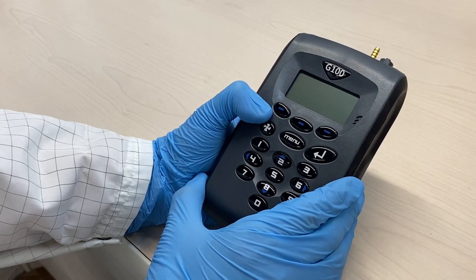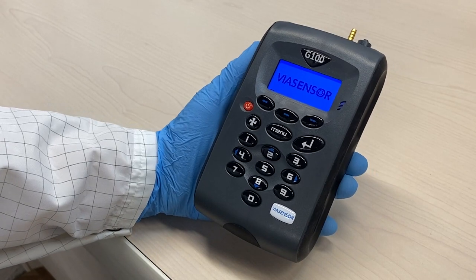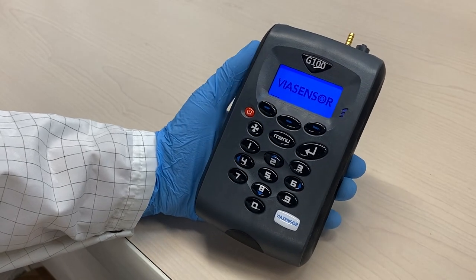Turn on the instrument by pressing the power button for a couple of seconds. The system will take about 15 seconds to self-test and warm up.